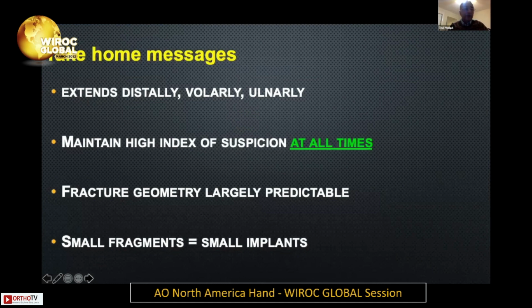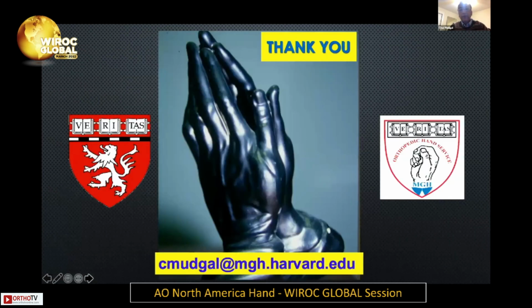The volar lunate facet extends distally, volarly, and ulnarly. You have to maintain a very high index of suspicion at all times to look for it and be prepared to fix it. The fracture geometry, in my opinion, is largely predictable, and small fragments require small implants.